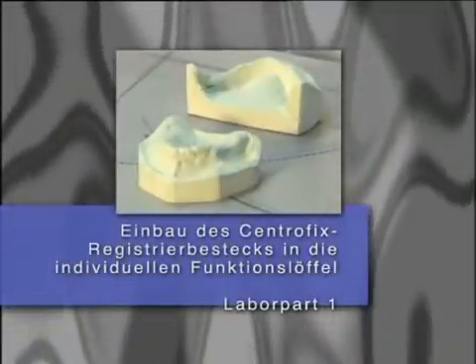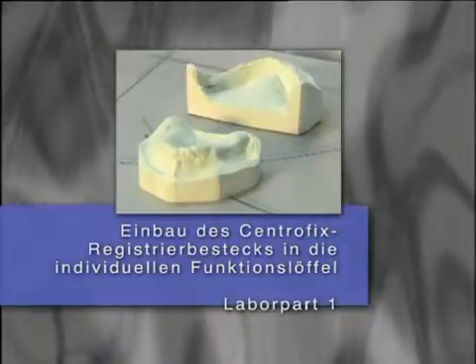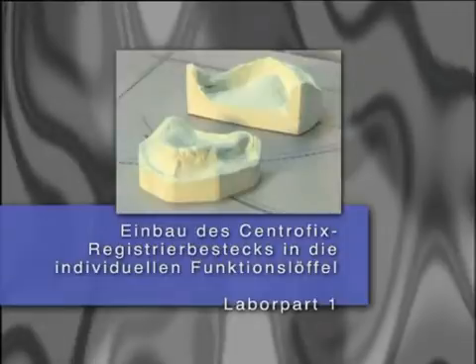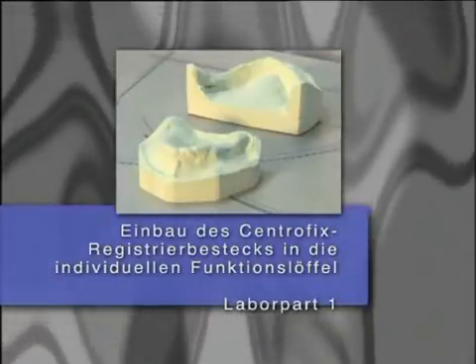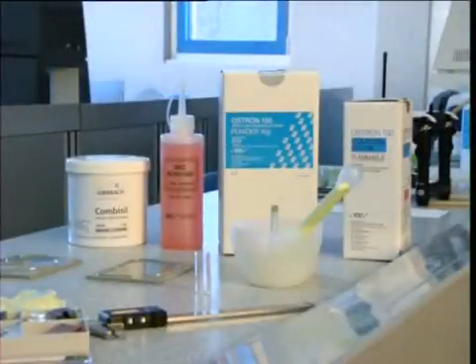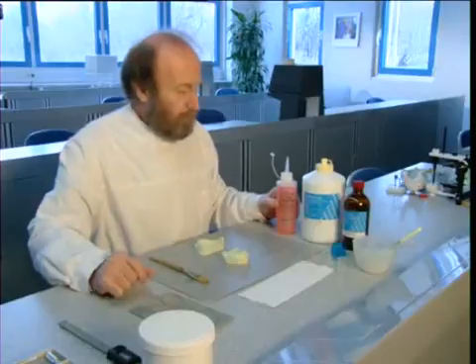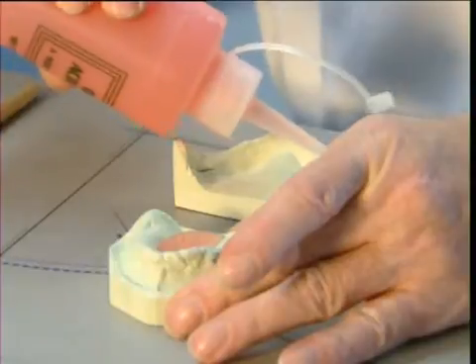Both anatomical impressions have arrived in the laboratory from the dental surgery and have been cast. Acrylic special trays are fabricated as usual for taking the functional impressions. The central fix instruments for intraoral Gothic arch bite registration are also fitted during this stage. The following are required for fitting the instruments: Ostron 100 cold curing tray material with accessories, Acrosep alginate separating agent, Combisil kneadable silicone, Vaseline, and a caliper gauge.